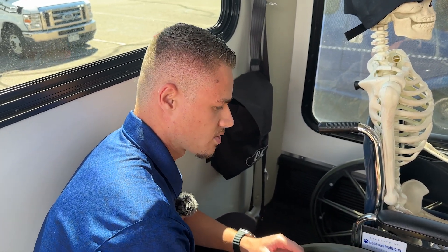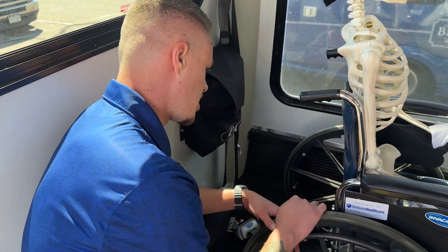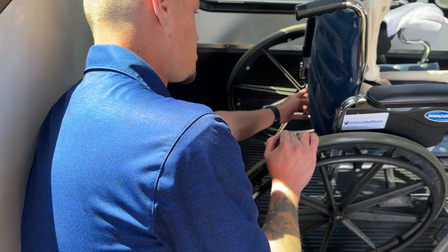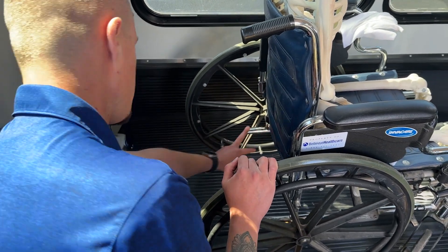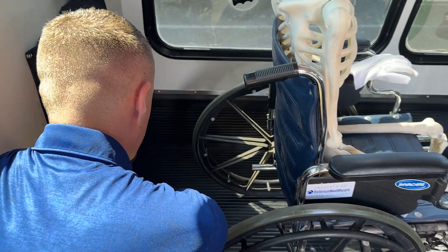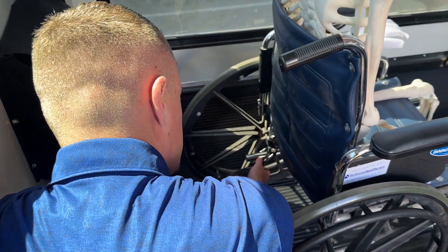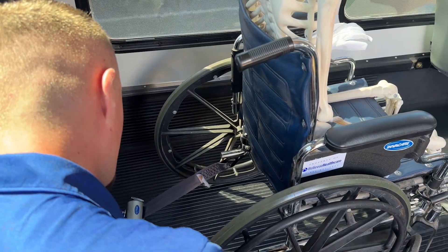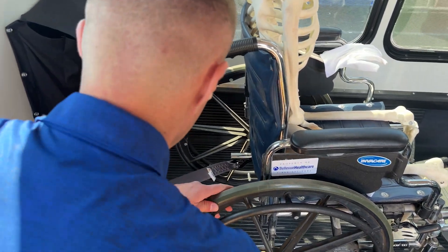You don't want to go through any wheels or through any cracks or crevices that might not be a solid member, just in case of an accident. On this wheelchair there's a 90-degree weld right here where the seat mounts to the wheel frame — that's where we want to secure. We'll press the red lever on the securement, pull it out, and hook from the inside to that welded member. Then we'll snug it up by twisting the sides for a nice tight fit.